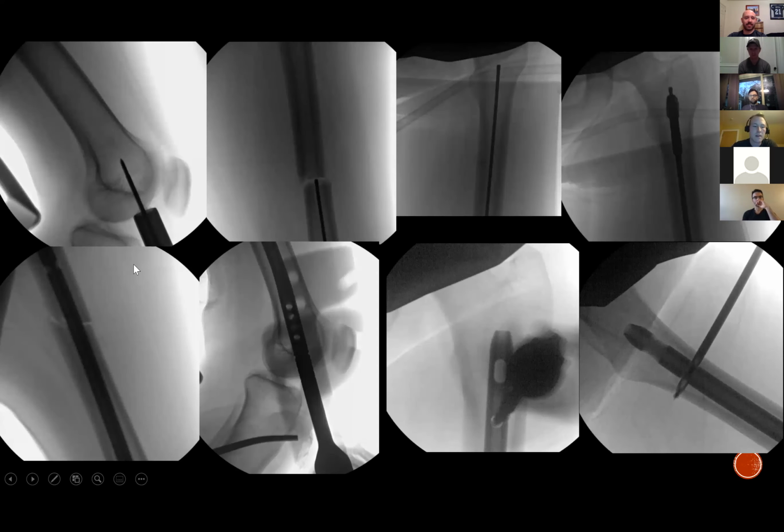Okay, let's imagine at this point right here with the beaded tip guide wire, if that was the reamer, the edges and the sharp cutting edges of this reamer would be knocking back and forth off of the inner cortex of this bone. And you can both hear and feel that as the reamer is advancing through there. That's what we call chatter.